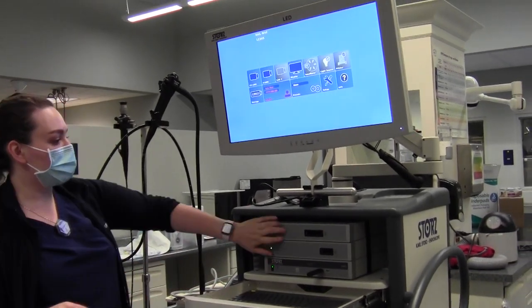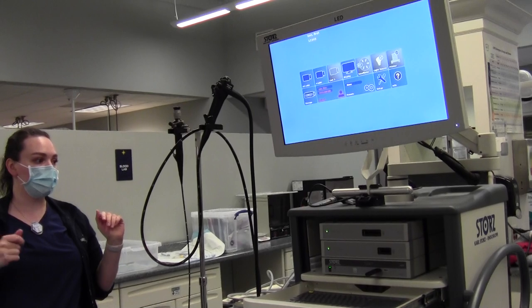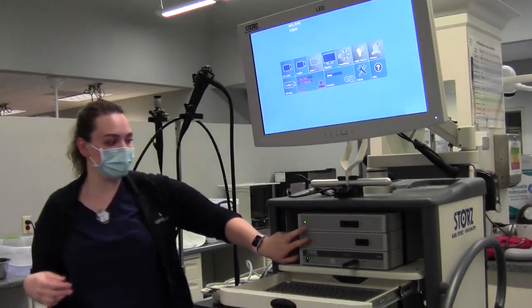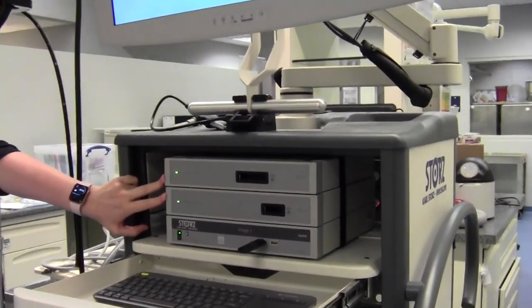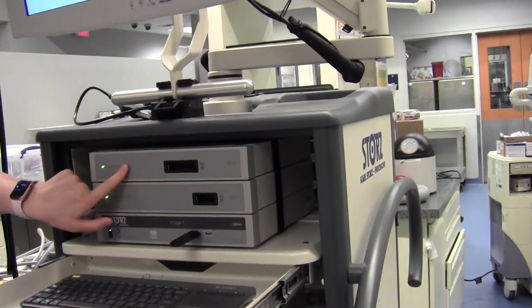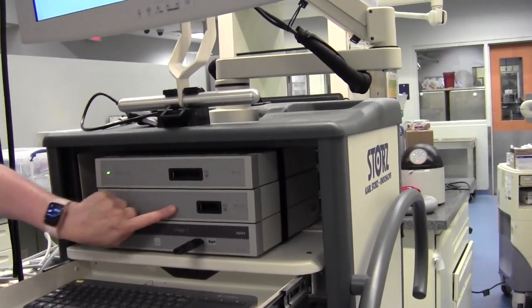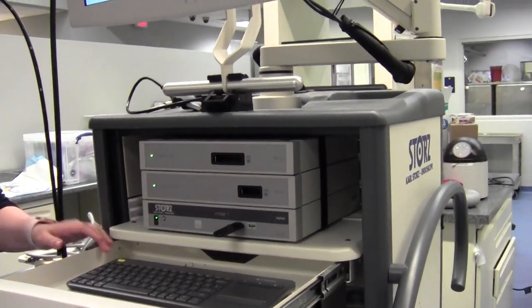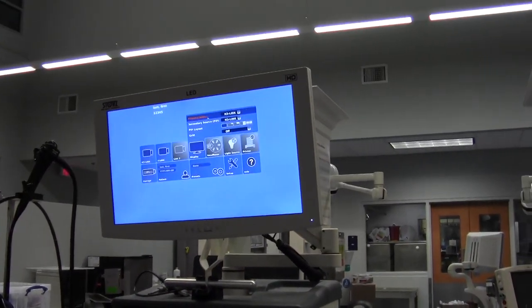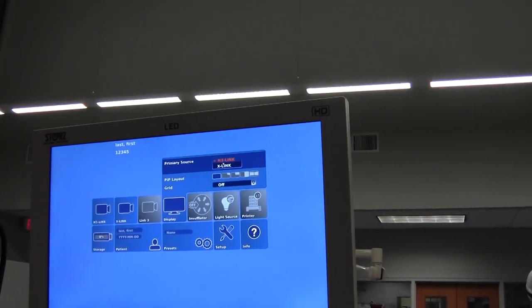There are different scopes, and some require different adapters or cameras to get an actual picture. There are two boxes here that have different video output devices. One is called X-Link — it's a much bigger piece opening. The next one is H3 Link, which has a much smaller adapter. It's important to double click on your display first and make sure your primary source is on the video output that you need — either H3 or X-Link.